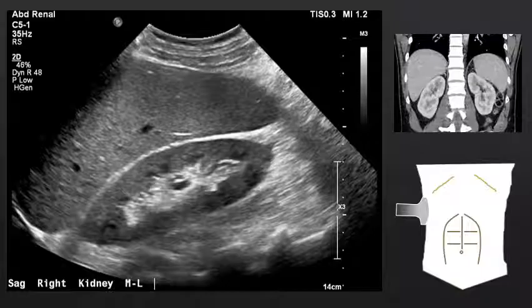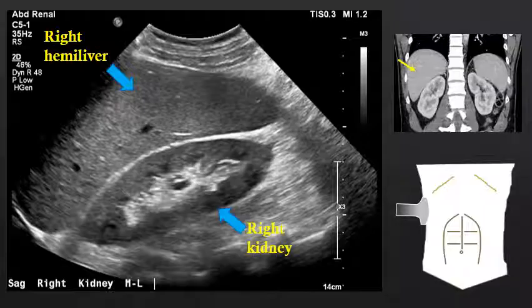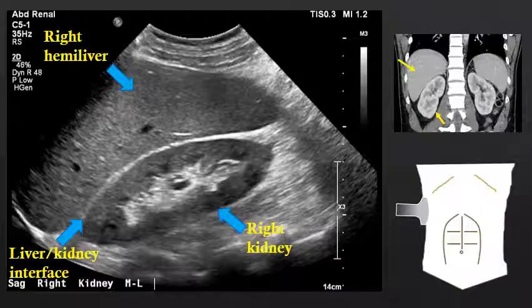If we move into a coronal orientation, we can see the liver-kidney interface extremely well. Superficial to the kidney in this orientation is the right hemiliver. We then see the right kidney deep to the right hemiliver. This liver-kidney interface view is important because it helps us assess the echogenicity of the kidney relative to the liver, which we will discuss in a future screencast.